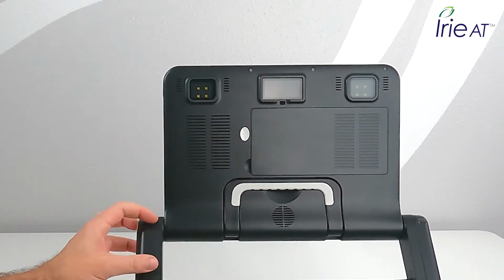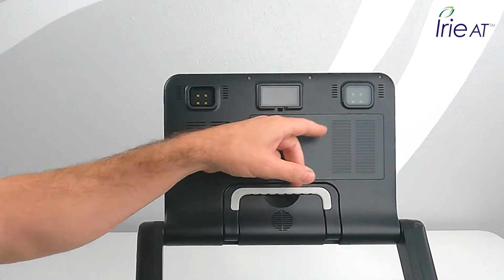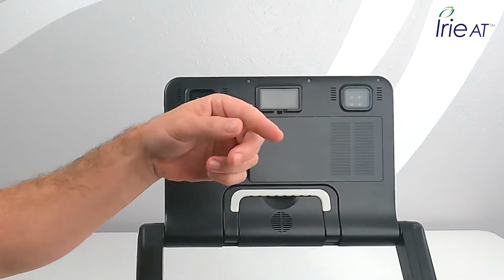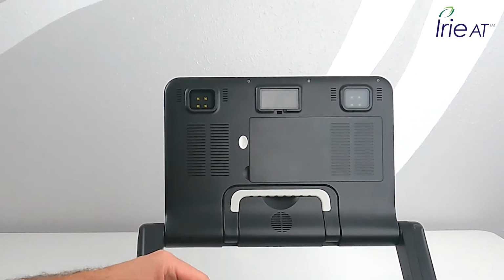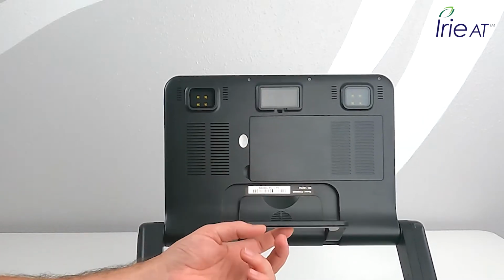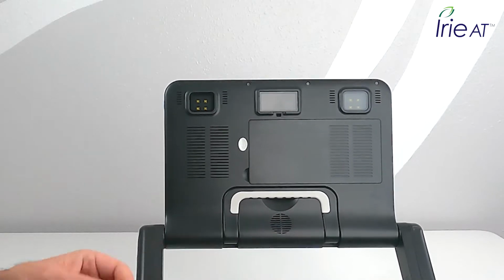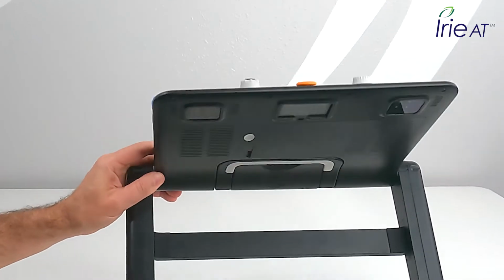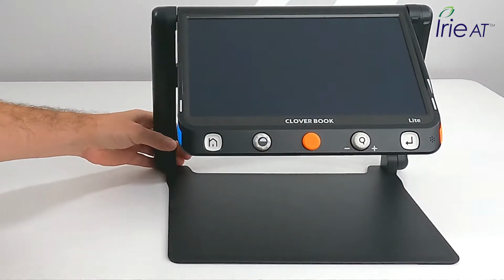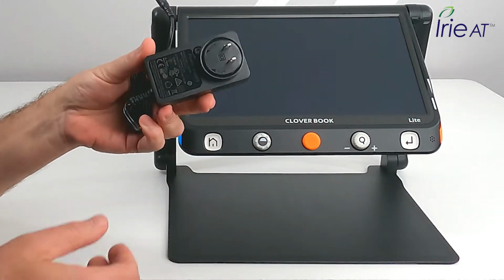As long as I have it tipped over, I'll show you the rest of the bottom. We have our LED lights, which you can adjust and turn on and off. You have your camera right in the center, facing right down. I'll explain some of the advantages of that later. Battery and battery release button I showed. You have a handle for carrying it around, getting in and out of the case, and then the speaker. All there right underneath the device. I'm going to get back to the power port here quickly, the power cord, and I'll show you.